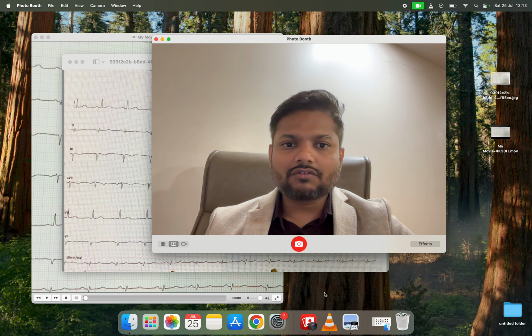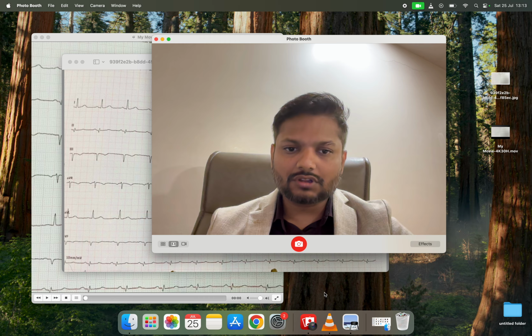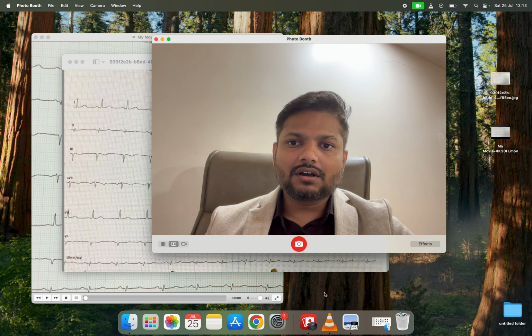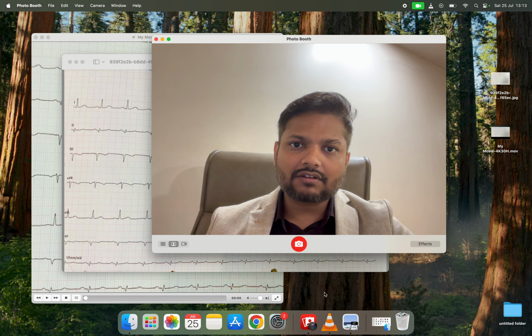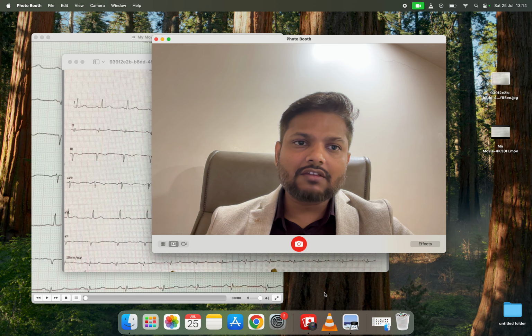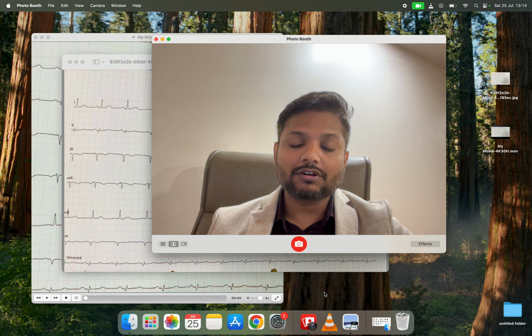So today, this video is both for the cardiologist and for the common public. We are going to discuss one case. This is the second case. Normally, whenever a heart attack case comes, most of the time there is only one blockage, and that artery we need to open by putting a stent. But this is a very rare case where we have encountered a heart attack with both arteries 100% blocked, and the patient is surviving on only one artery. The patient has arrested, and somehow we have taken him for angioplasty to save this patient.